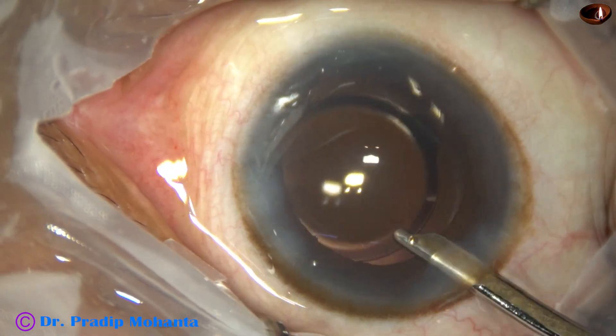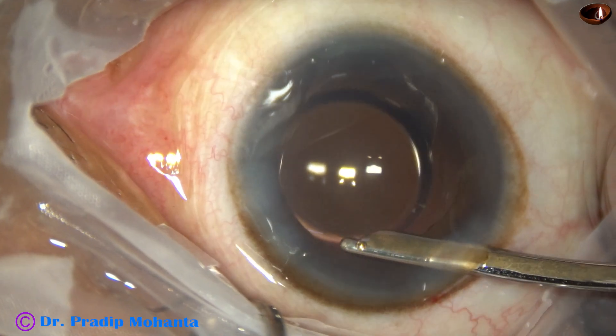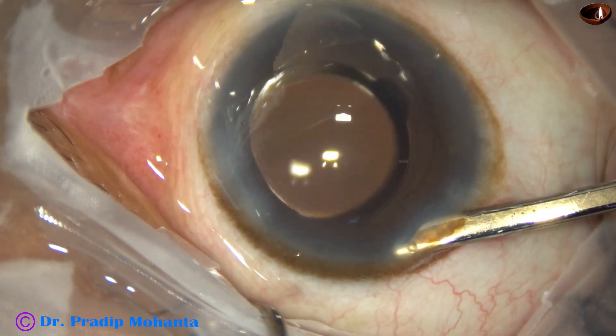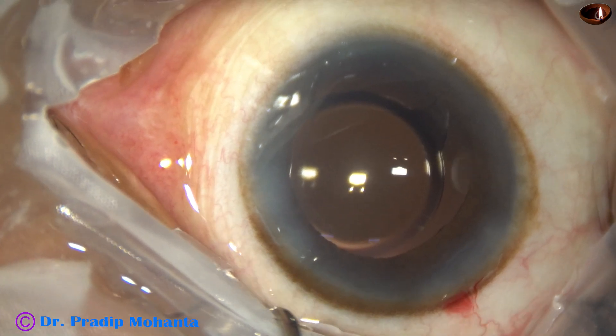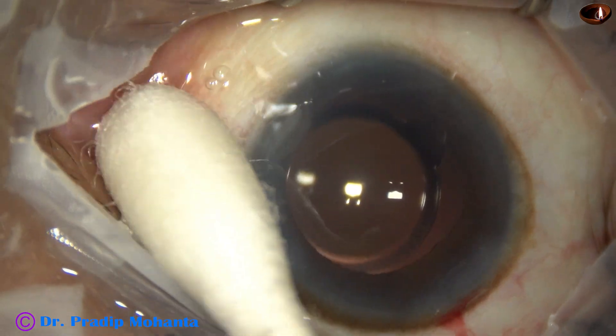This is the final lavage of the anterior chamber. Any viscoelastic on the corneal endothelium is removed, the anterior chamber is nicely formed, a few drops of moxifloxacin are applied over the ocular surface, and the integrity of the wounds is checked.